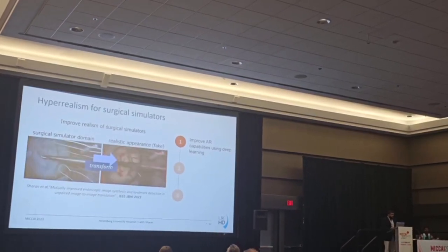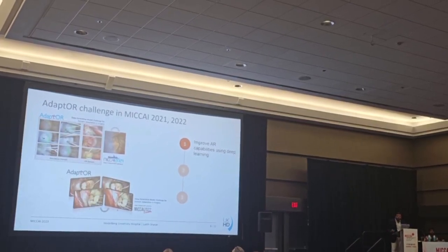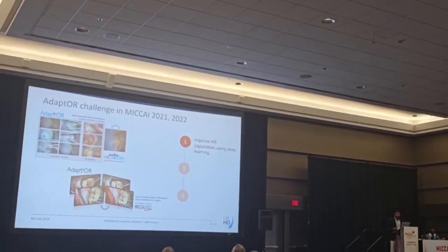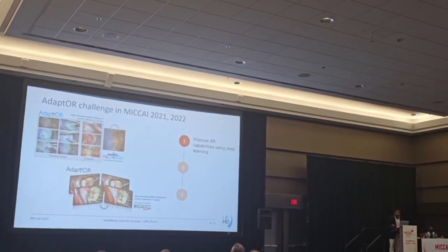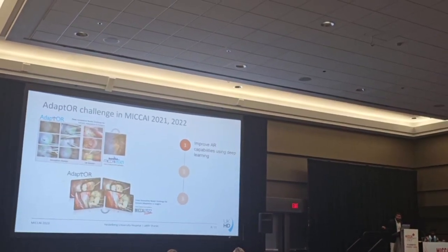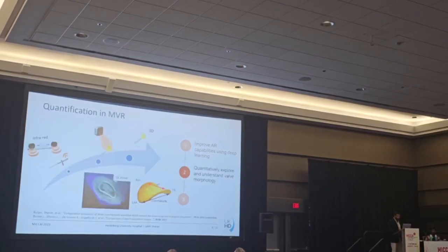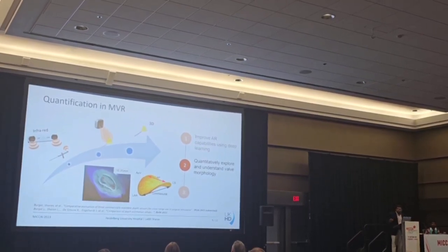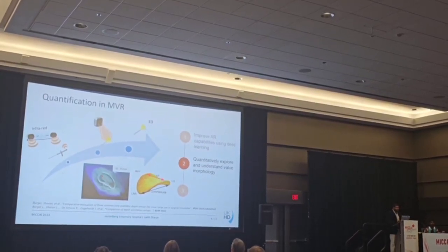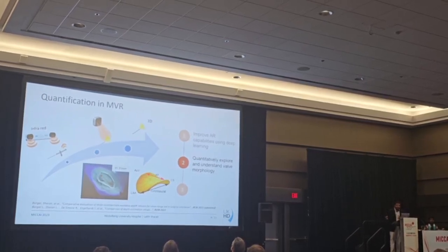And all of these were performed on a data set that we acquired in Heidelberg University Hospital, and we released it to the MICCAI community in the last couple of years, firstly with point labels and then a bigger data set without the labels. And the second task is to reconstruct the scene in 3D, because it really helps to know quantitative measurements of the valve to make surgical decisions.